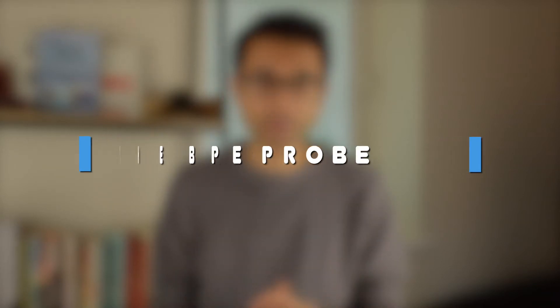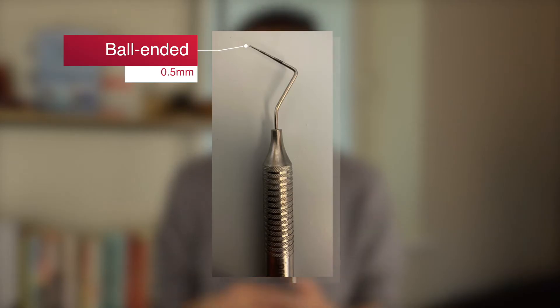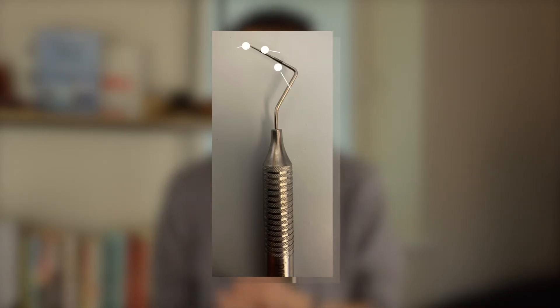So which instrument do we use to carry out a BPE? We use the World Health Organization or WHO probe, which has several markings to help us. On the end there is a 0.5 millimeter diameter ball end. There are then two black bands on this probe, one running from 3.5 millimeters to 5.5 millimeters, and then the other running from 8.5 millimeters to 11.5 millimeters.